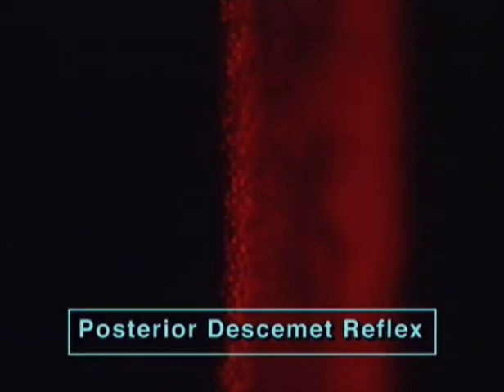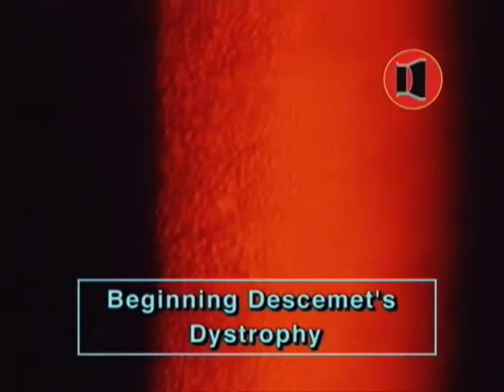Posterior Descemet reflex. This next case shows a posterior Descemet reflex in early Descemet's dystrophy, which at first glance appears like an endothelial cell pattern. However, when we change the illumination by slightly tilting the contact glass, this pattern changes drastically.